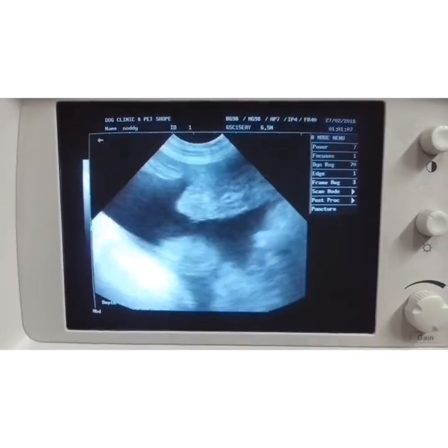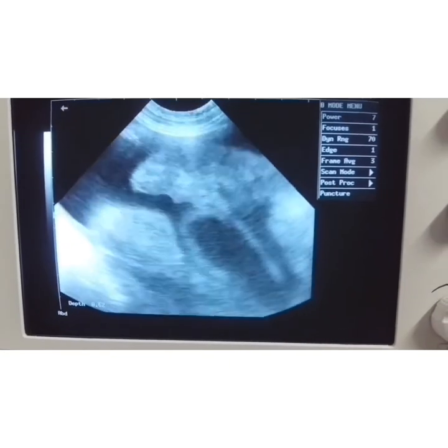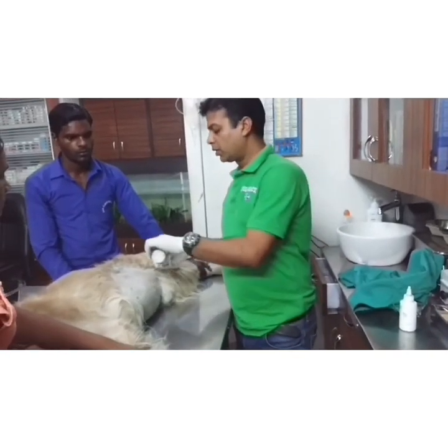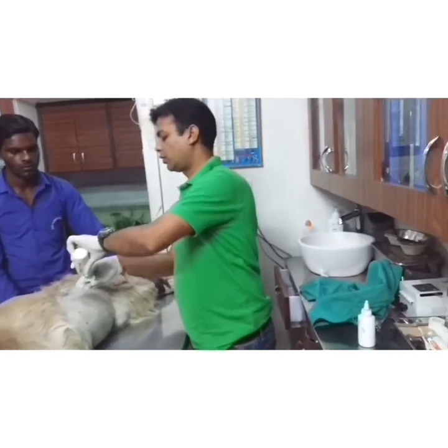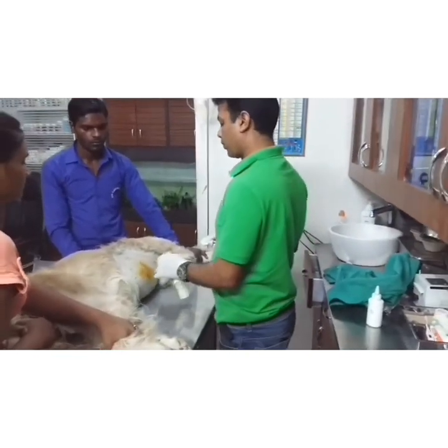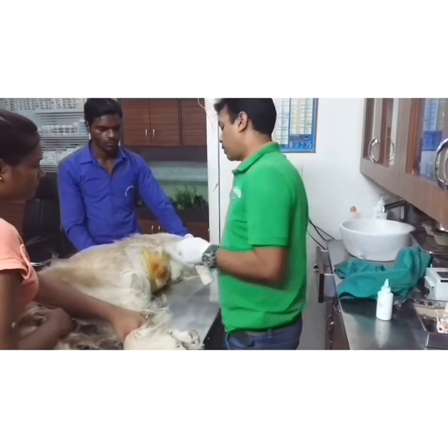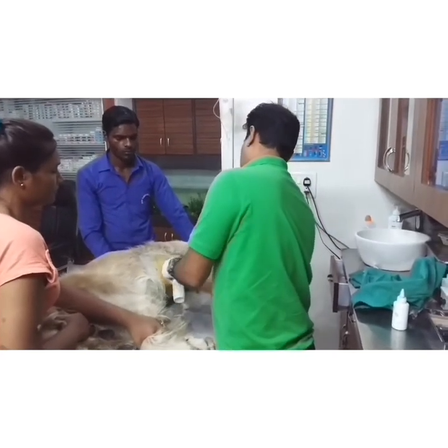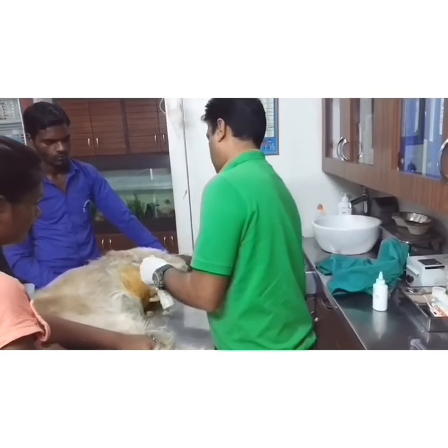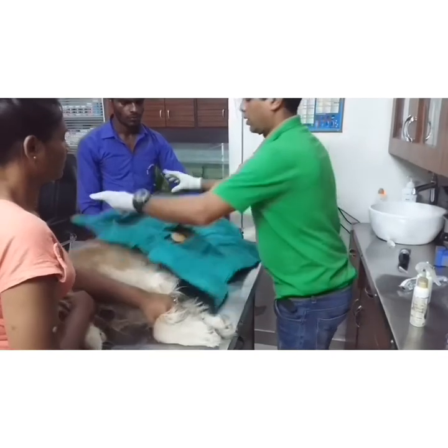In this case of ascites, I will now collect the ascitic fluid by paracentesis to examine the fluid. For the paracentesis, first shave the area properly, then clean with antiseptic solution. I am demonstrating how to collect the fluid by paracentesis in the case of ascites.